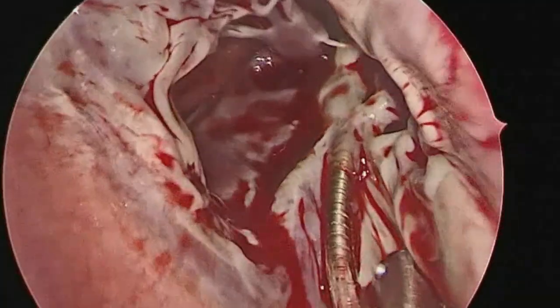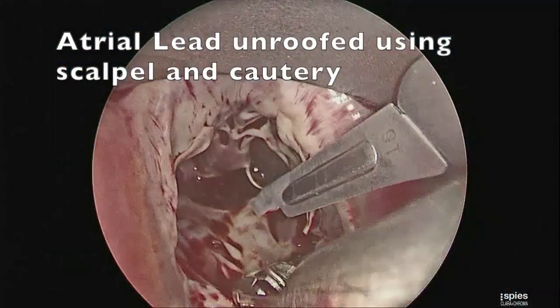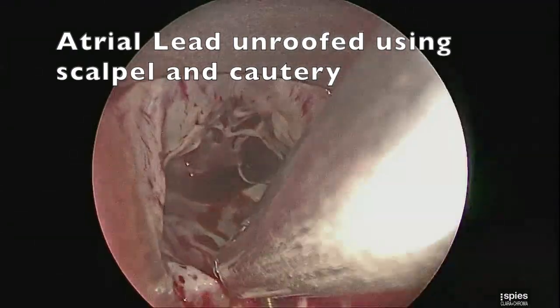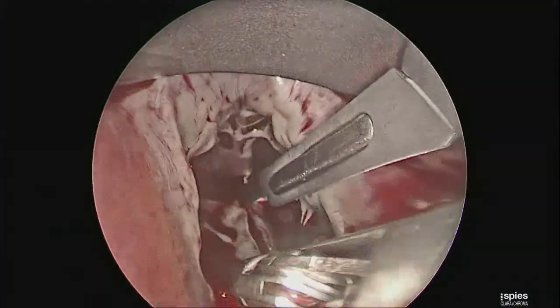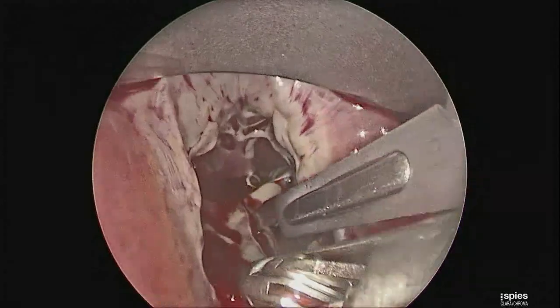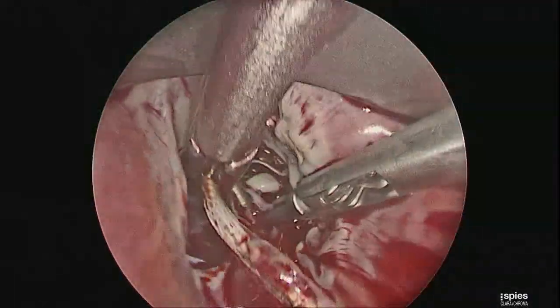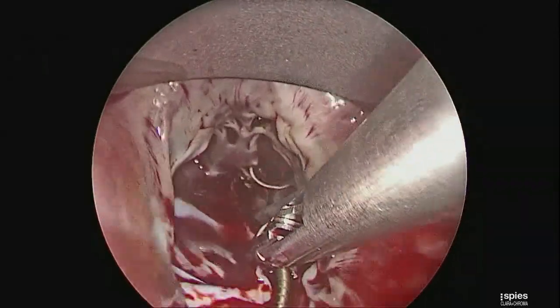One can appreciate the restriction of the leaflet by the scarred-in lead. The lead was unroofed using a technique of a 15-blade scalpel gently scoring over the scar so as to unroof the lead. Using sharp dissection and bovie cautery at 10, the combination of these two techniques was used to release the lead.